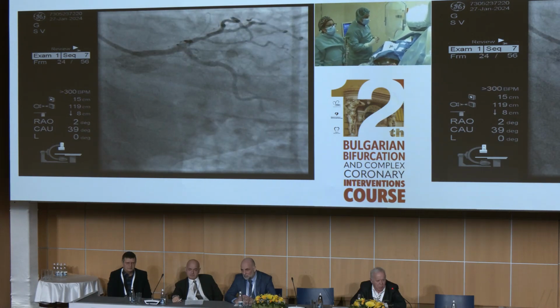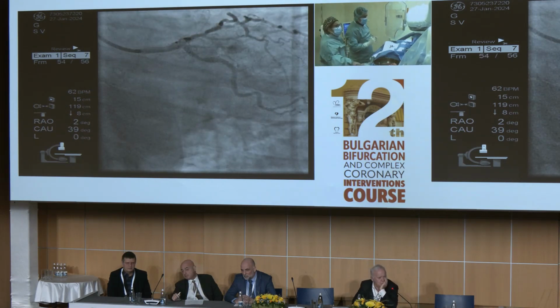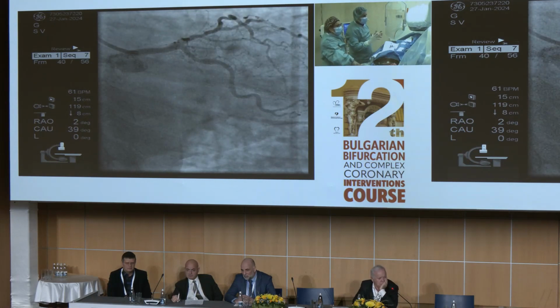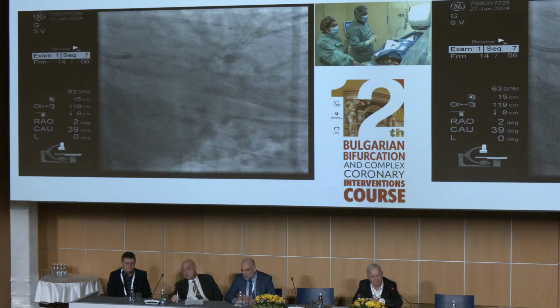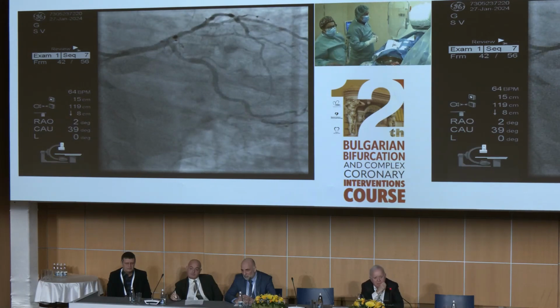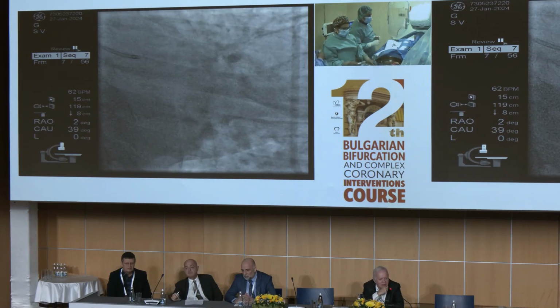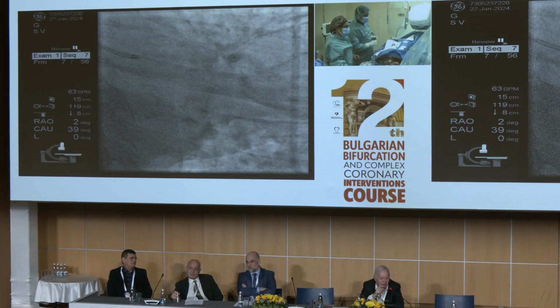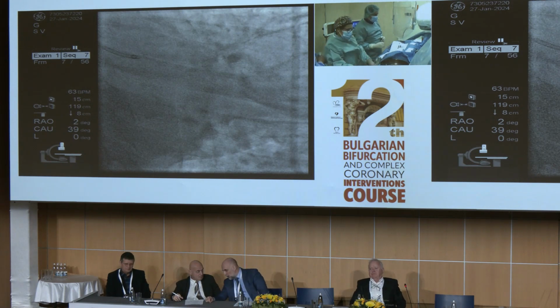Our strategy we discussed yesterday was doing IVUS to assess how tight the stenosis was and whether we have a landing zone in the proximal part. Angiographically now we feel confident about that without IVUS, and essentially just to settle the strategy for the bifurcation stenting. In my place, we would use angio guidance only. But no, leave it, do it. I will explain while you are doing it with IVUS how we would do it without IVUS. Perfect, that will be totally educational.